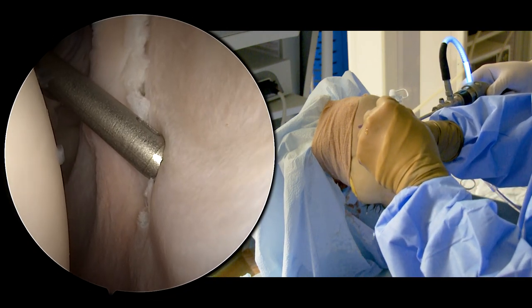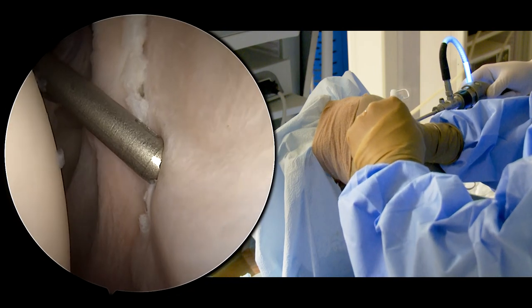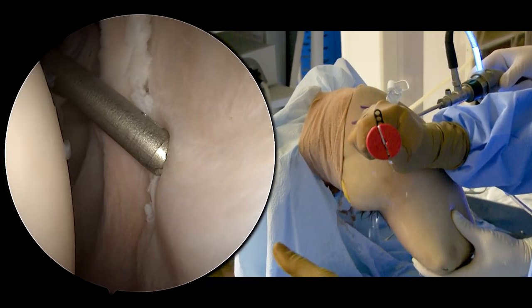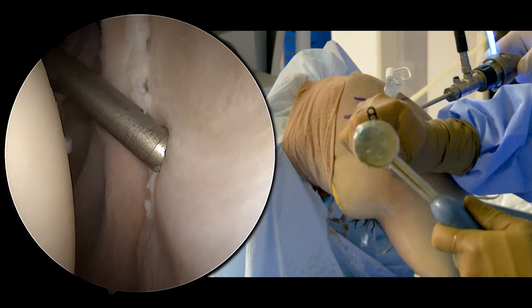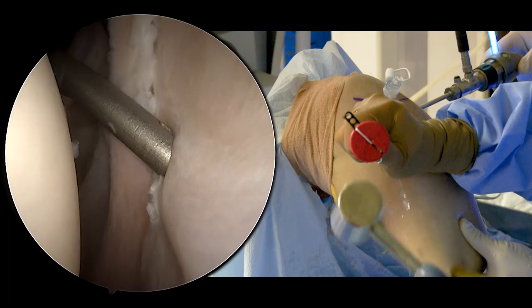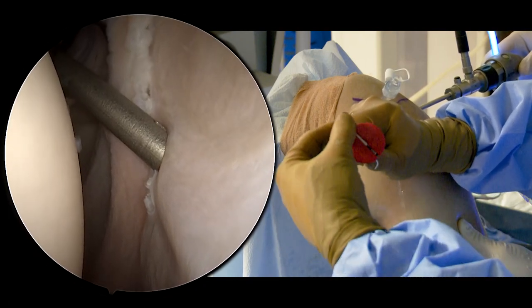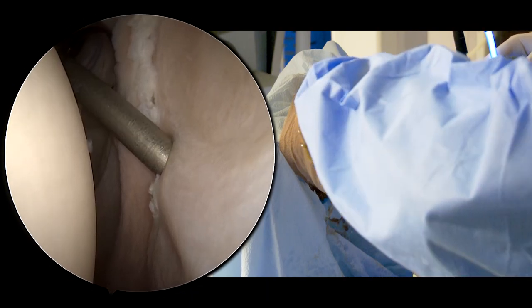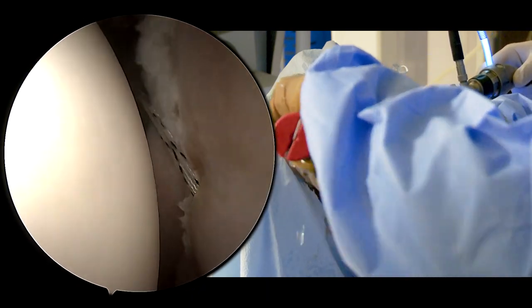We try and start this by hand into that hole, and then we'll tap it into place. There's a little grommet here that you can remove that releases the sutures, and then we just pull everything out.